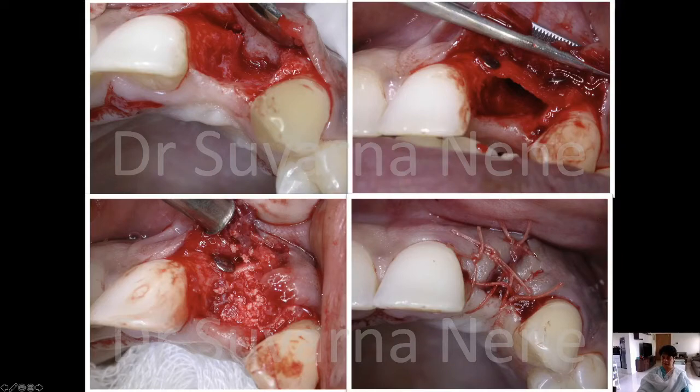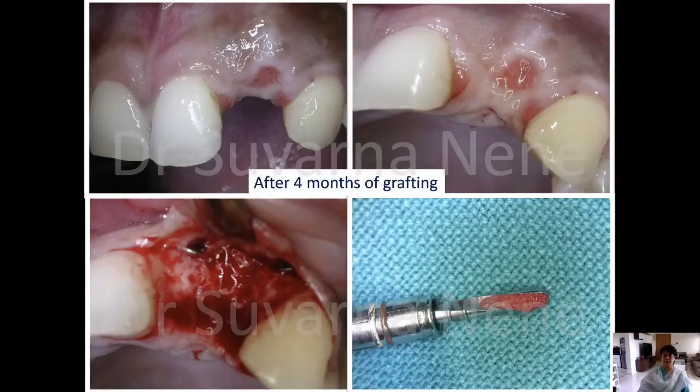But here you can see some laceration in the soft tissue in the vertical region, and that's why I also had to close it. Now, why does this happen? This happens because, first of all, when you remove this tissue, the flap becomes too thin. Secondly, if you've not taken any vertical releasing incision, or if you've not opened any adjacent papillae, then raising this flap can also cause this. And the third reason could be that the soft tissue which had healed on the socket was not tough enough to raise it. And if at all it happens, close it before the main closure.